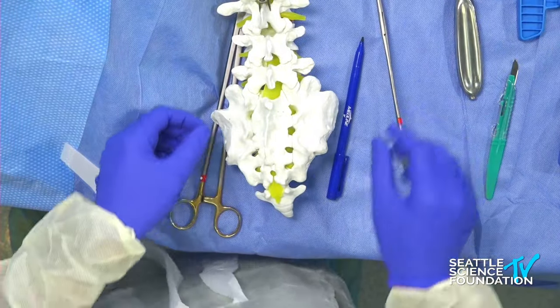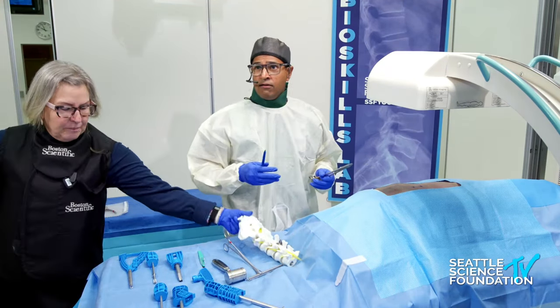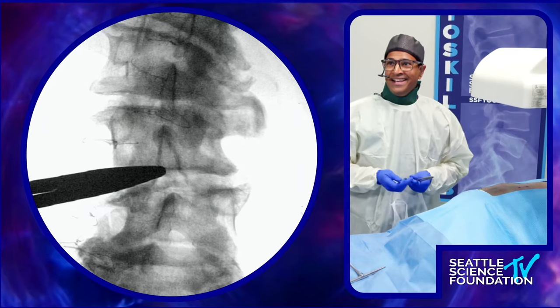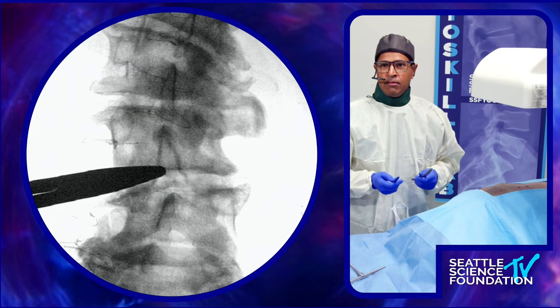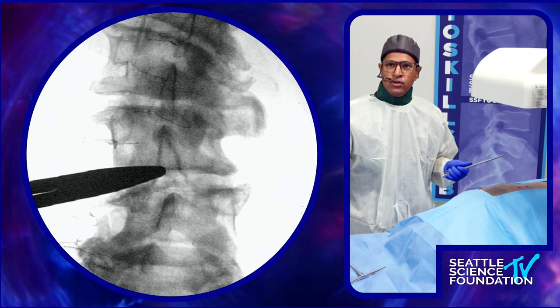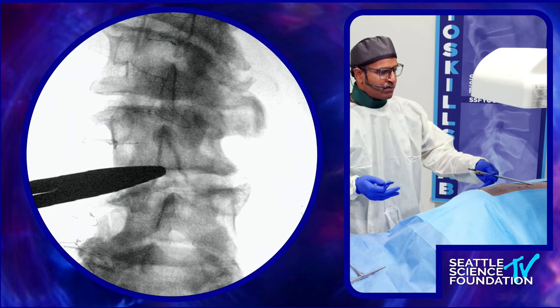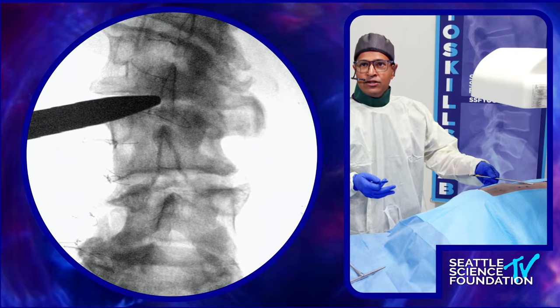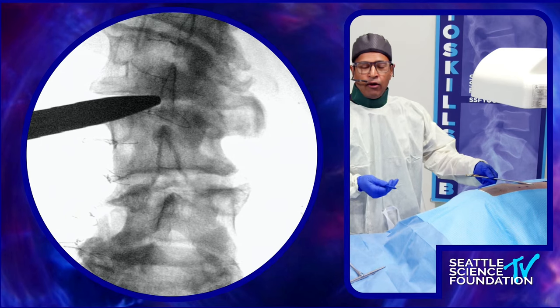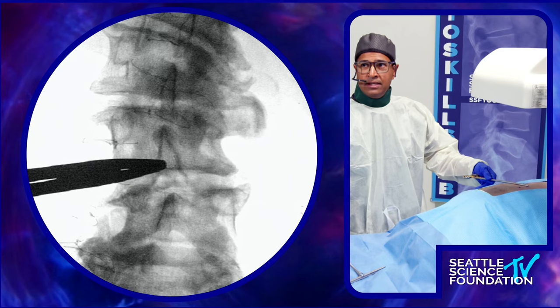The way that works — if we look at the fluoro shot, hopefully you guys can all see the fluoro right now — we have a typical spinal stenosis patient with a degree of scoliosis in the lumbar spine. Looking at the interspinous space at L3-4, I'll show you what the L3 spinous process is — that's this one right here. You can see that angulation towards the right side at L3 in comparison to L4.